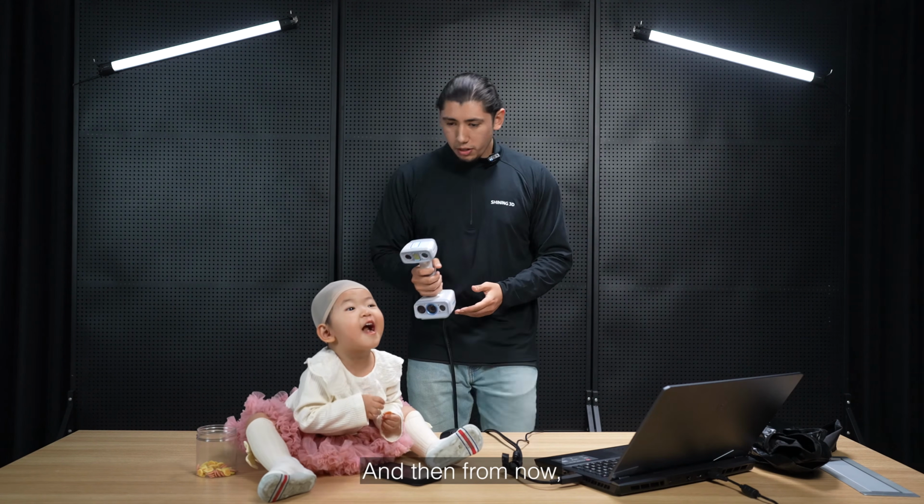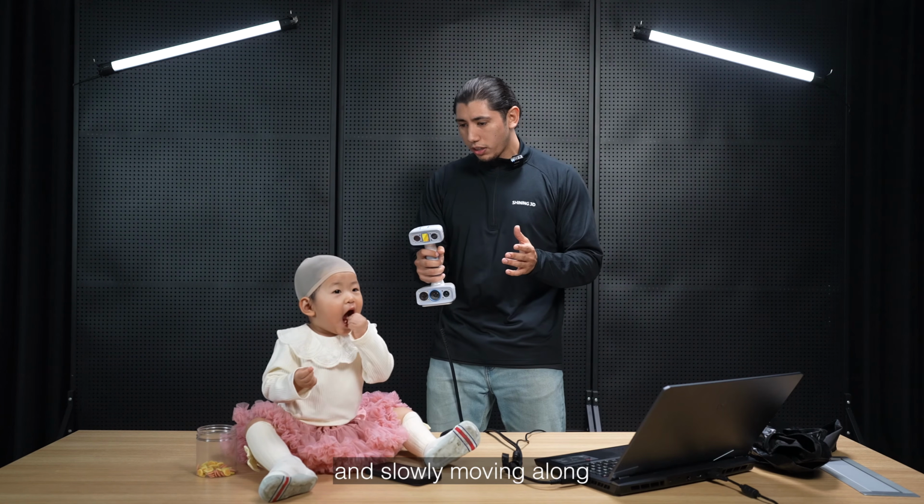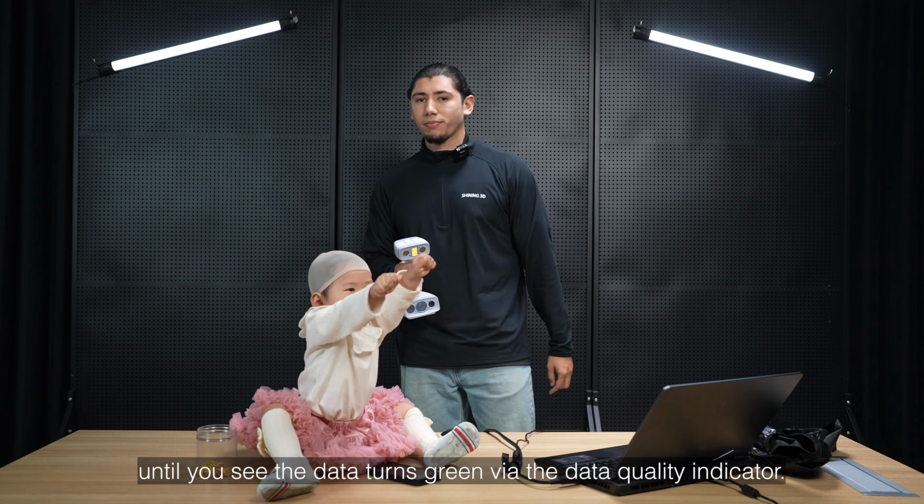And then from now, when you are scanning, you want to make sure you're thoroughly scanning one area and then slowly moving along until you see the data turns green via the data quality indicator.